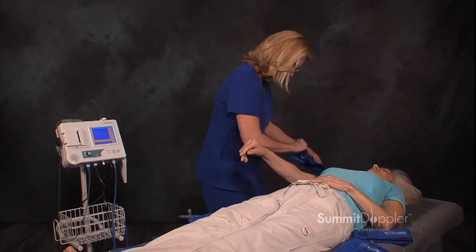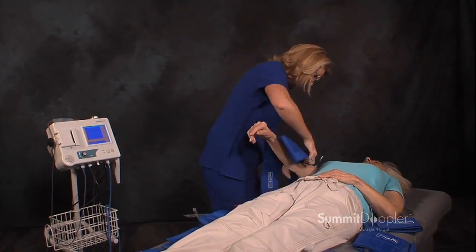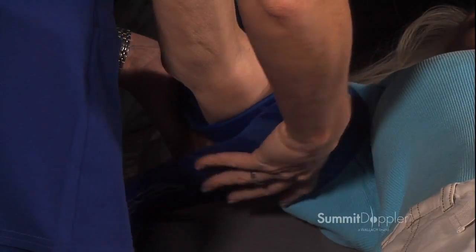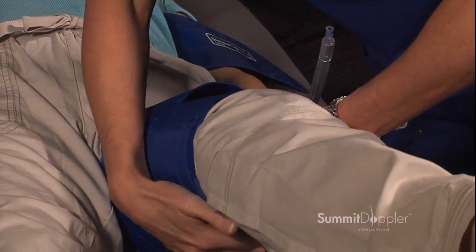To prepare for the exam, first wrap the blood pressure cuffs at all sites. Typically, use a 10-centimeter cuff for the ankles, a 12-centimeter cuff for the arms, calf, and above the knee, and finally a 17-centimeter contoured thigh cuff for the thighs.